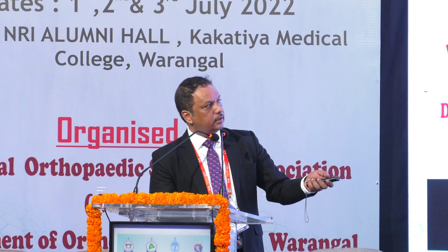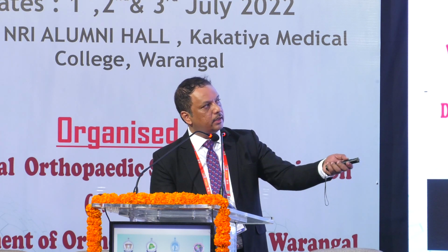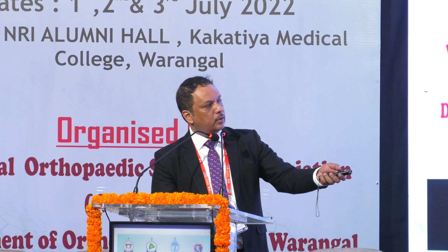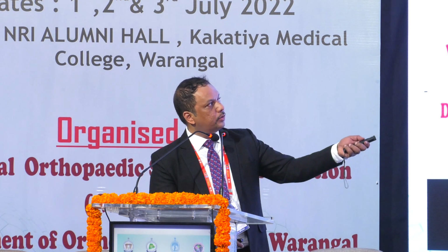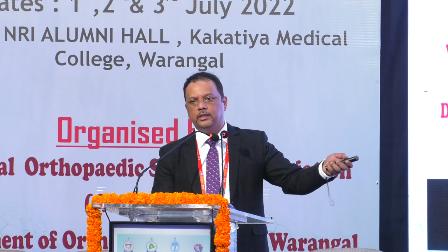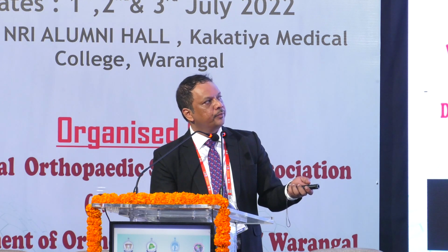This is another case. If you look, this is a major fragment here, a lunate facet fragment. If you look at the CT there, you know why this is the problem. These are very dangerous injuries in the sense that they usually have a late collapse, however nicely you fix them, okay? And you need to use a lot of techniques here.